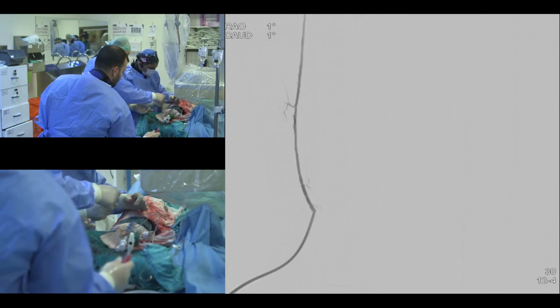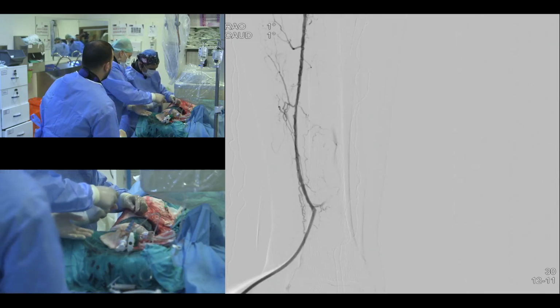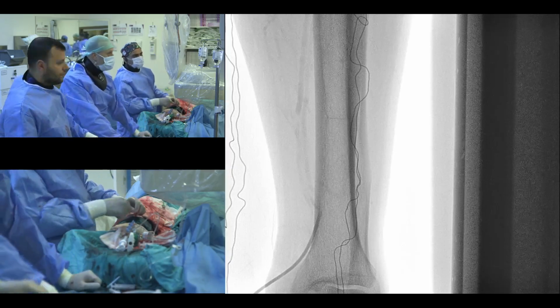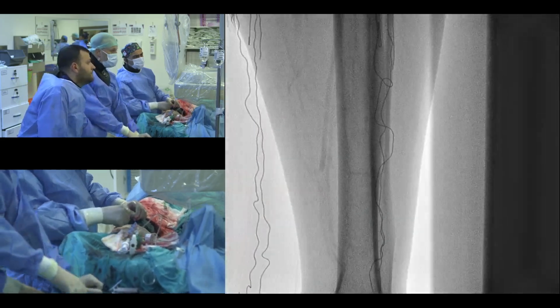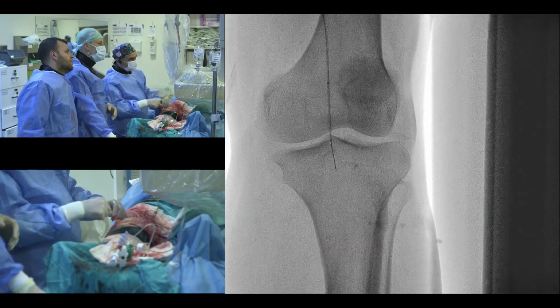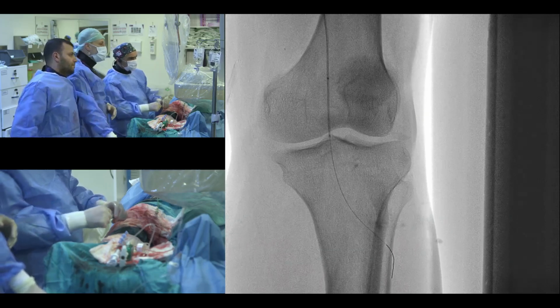So heavy calcification, long lesion, more than 20 centimeters, think twice. Make sure there's a good reason. So it's gangrene or wound or rest pain. If they don't have this, the vessel is not going to stay open even if you open it up just for claudication. It's going to shut down.